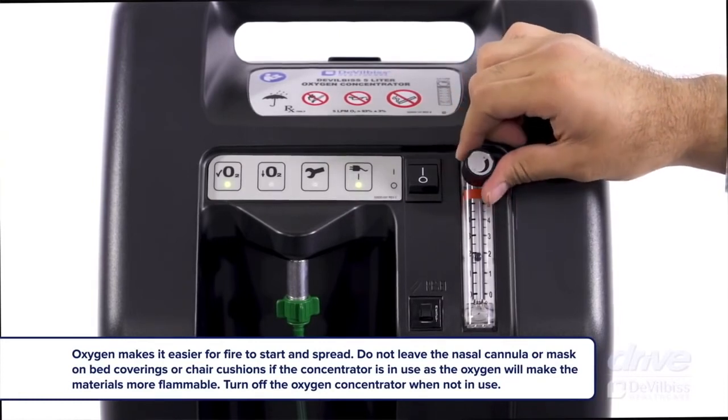So this is the way one can use the setup at home, but again the key thing to remember in the situation of COVID-19 infection is that if your oxygen level is less than 94%, or respiratory rate more than 24, or you have a subjective feeling of breathlessness, you must seek medical attention immediately.